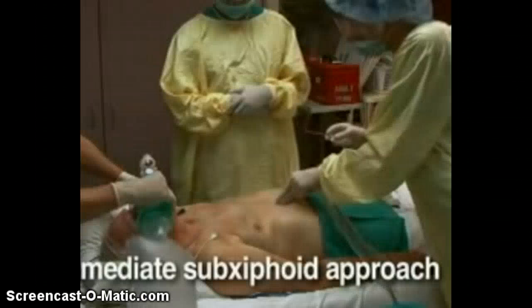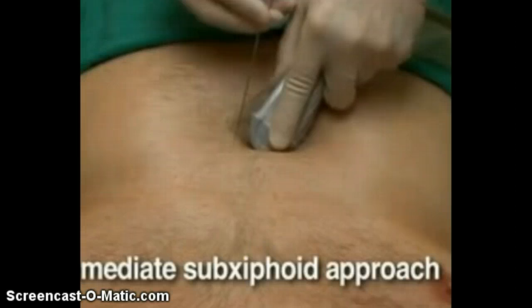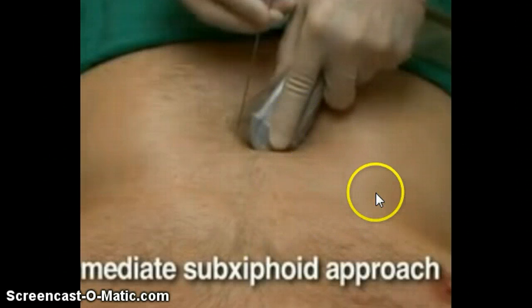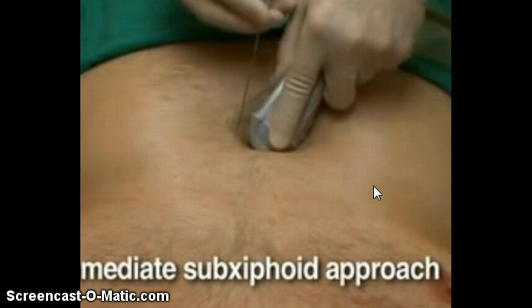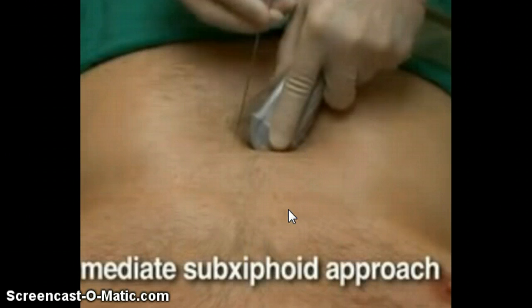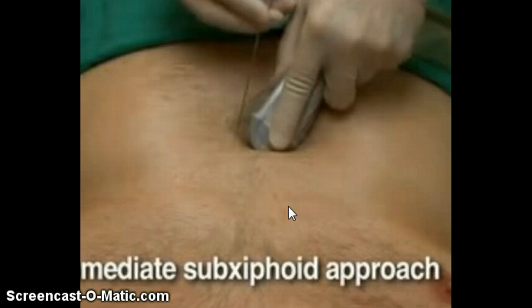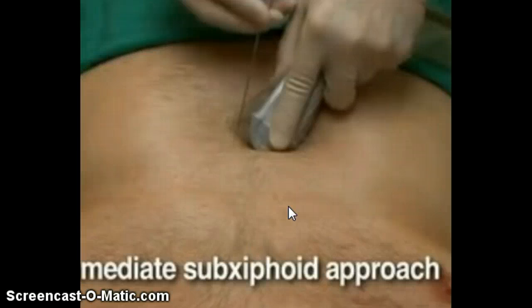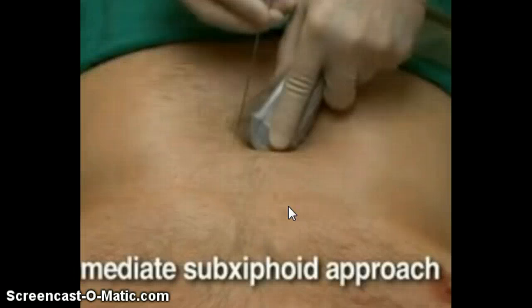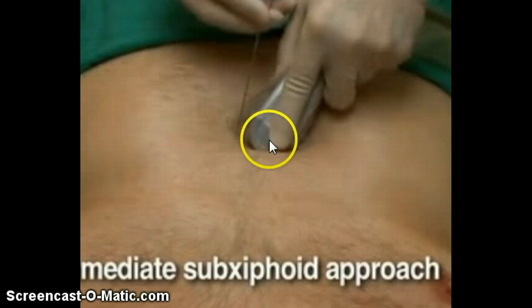Here's a video that demonstrates the procedure. One thing to point out is that this is done in the cardiac cath lab most often, but just because it's done in the cath lab doesn't mean x-ray is used. A lot of times this is done under ultrasound guidance. It could be done at the bedside if an ultrasound machine were brought there, but it's typically done in the cath lab because the table, sterile drapes, chloroprep, and scrub assistant are all already set up.